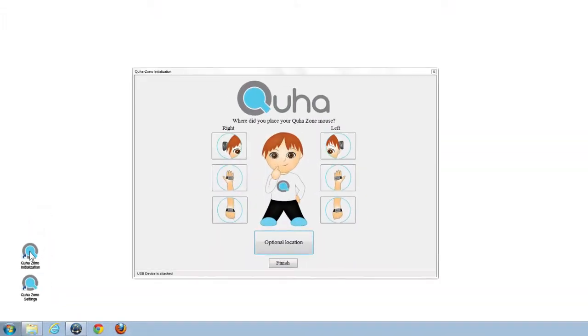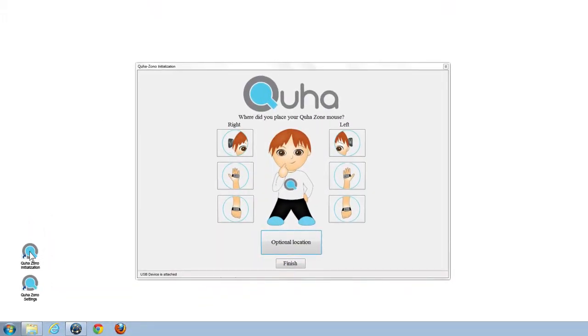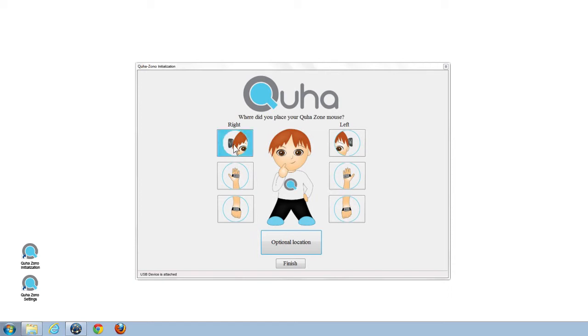Third, have you configured ZONO to be used in the position you are currently trying to use it? ZONO's movement directions can be fully customized using the configuration tool to match your needs, and a ZONO configured to be attached on your hand will not function logically if attached on your foot.